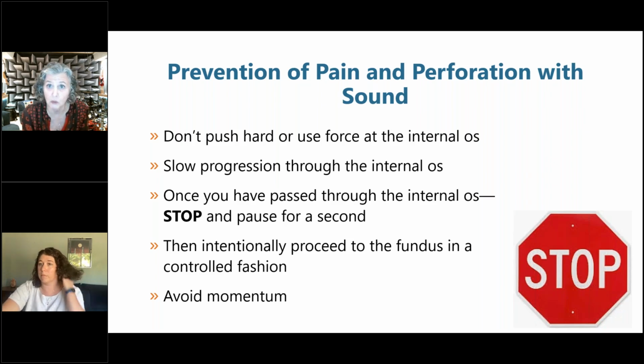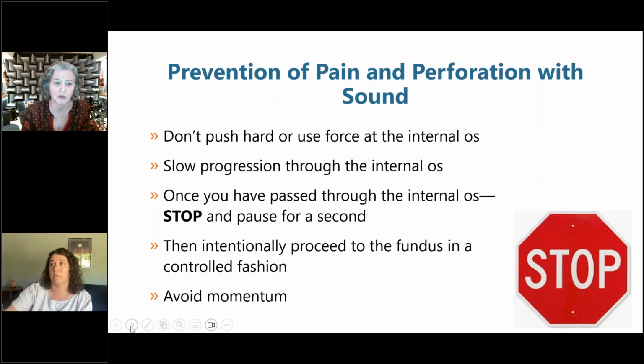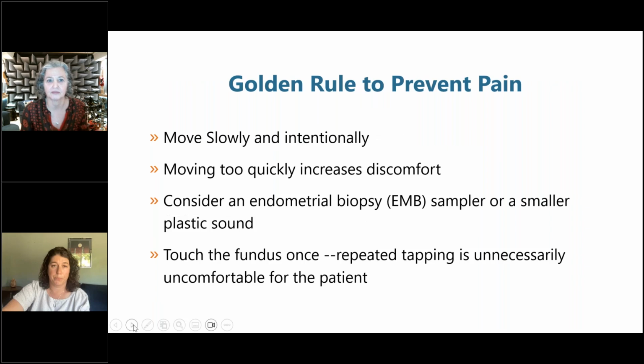Just touch the fundus once without tapping it to make sure you're in position, just once, because it is painful. And it's the momentum that we want to avoid. That's where we're concerned that perforations will happen. So you want to avoid that momentum and instead stop after you've gone through the internal os. Move slowly, move intentionally. When you move more quickly, it increases discomfort, also increases the risk of having some momentum.